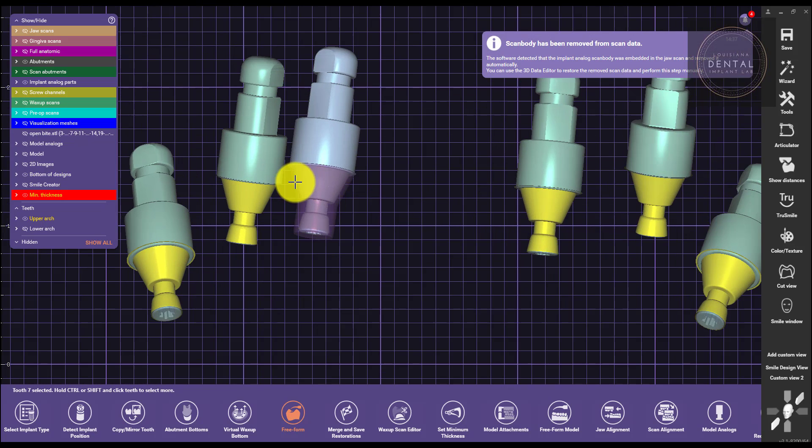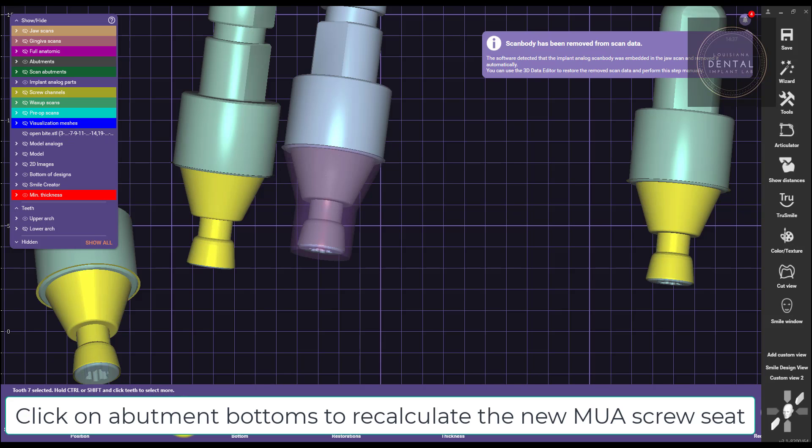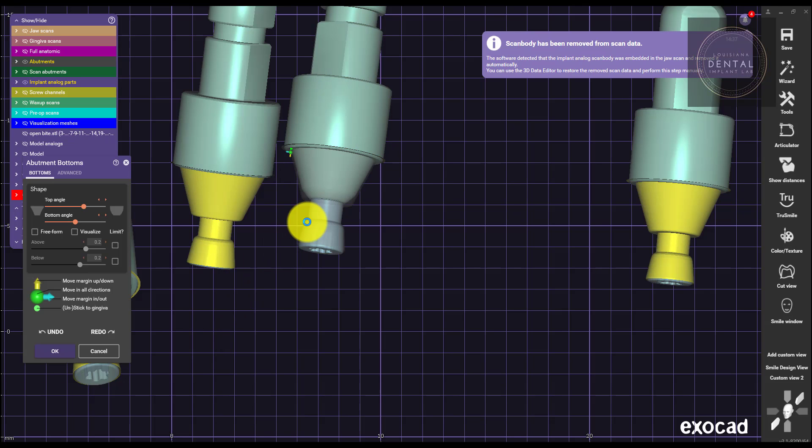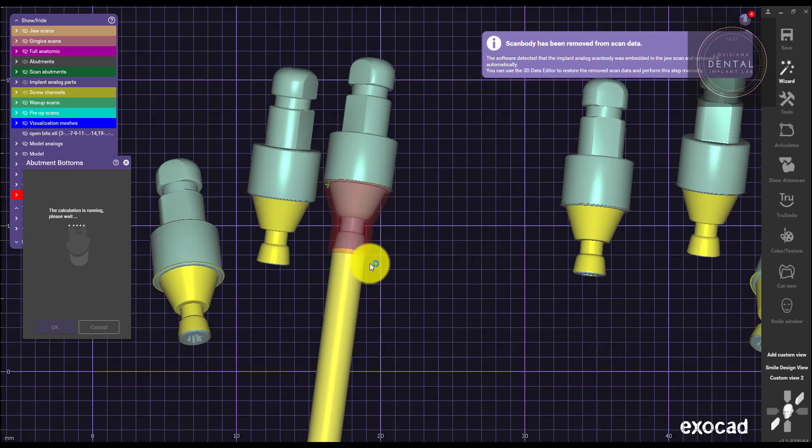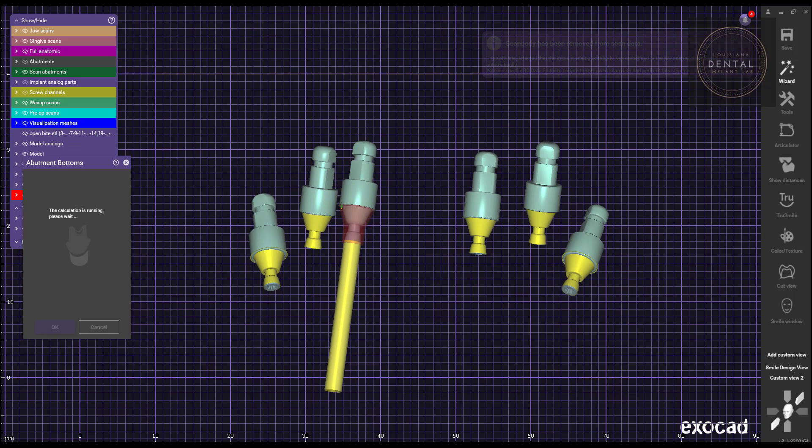Always press OK. Then from here, all we have to do is recalculate the abutment bottoms for the new MUA screw seat. After it's calculated, you're all done.